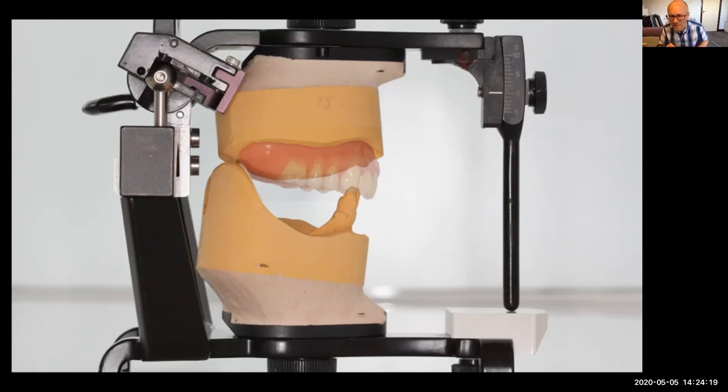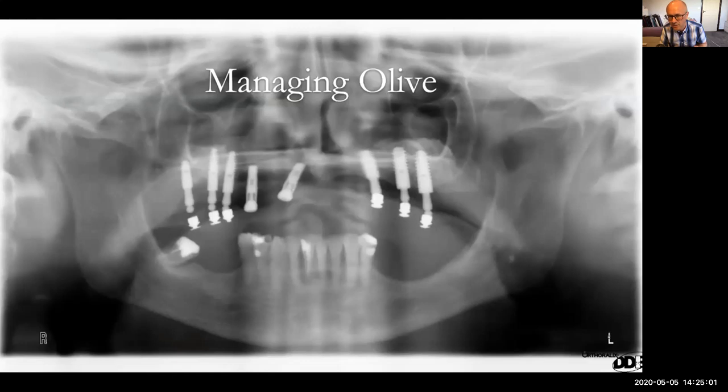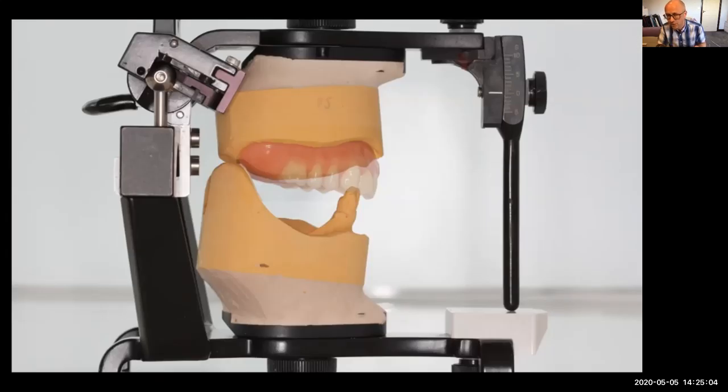But when we actually came to set the teeth up with the right aesthetics, we couldn't use porcelain teeth at the back, because porcelain teeth don't bond to the acrylic chemically. They have to have little holes that retain them inside the denture. So we gave her ceramic teeth at the front, upper 3 to 3, because there was space to do that. But at the back, we had to use our standard acrylic teeth, and then Rowan can cut them right down so they fit right onto the ridge, and then they get processed into the denture just like that. So that's why this was an interesting case for me.